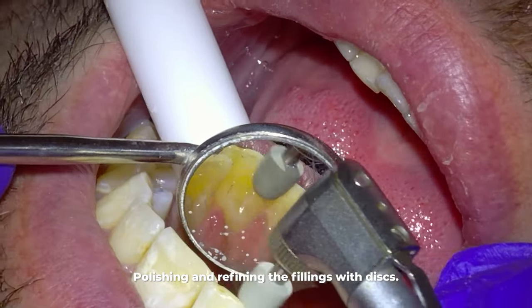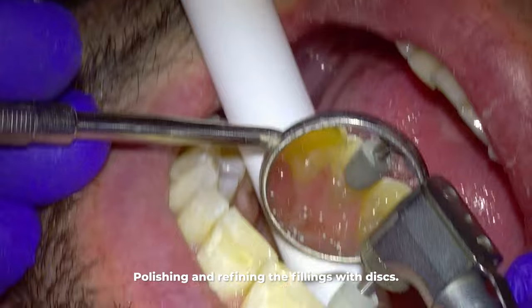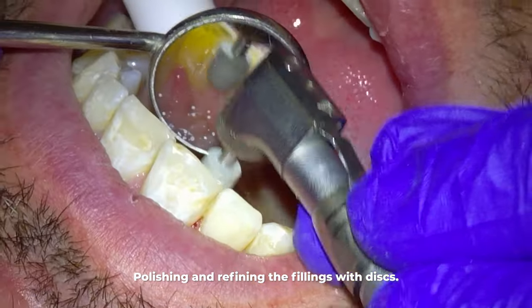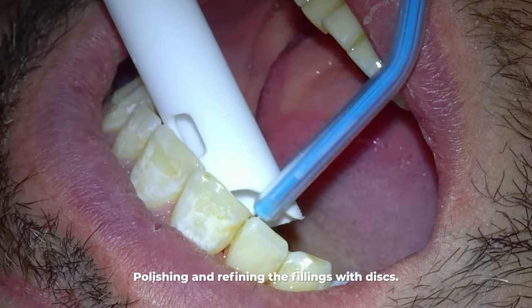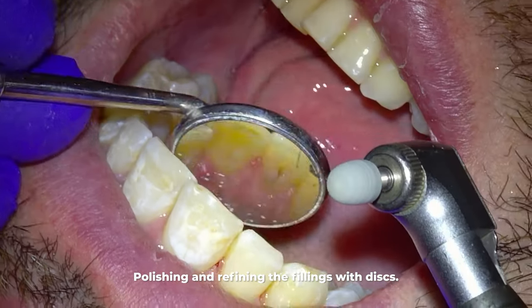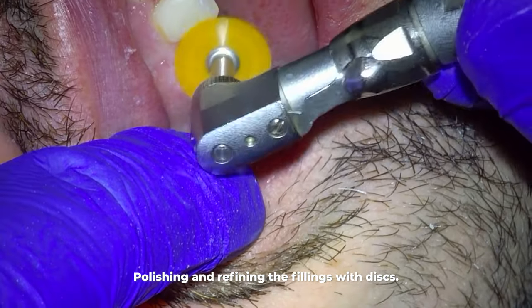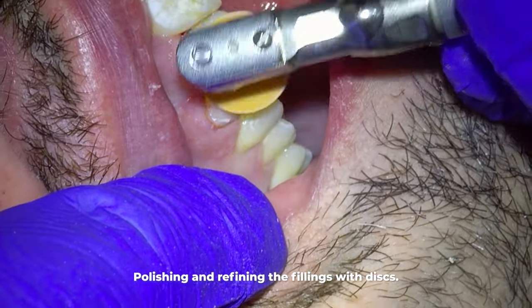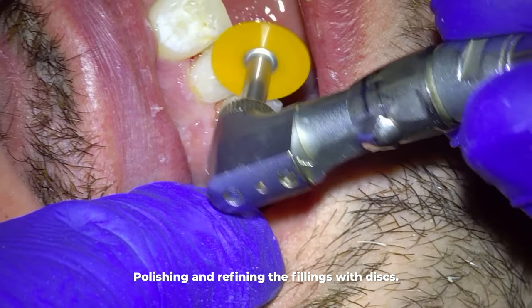We've mostly just done some bulk refining, but to make it look really nice I use a series of discs — these polish and refine it so that it looks nice, smooth, and shiny. Then this blue paper is to make sure the patient is biting evenly on their teeth and fillings. After I have them bite on the blue paper, if it leaves a big mark on the new fillings we know the filling is too high and we have to file it down a little. Otherwise their bite will be off and they'll feel like they're just hitting on these two teeth and not able to bite naturally.